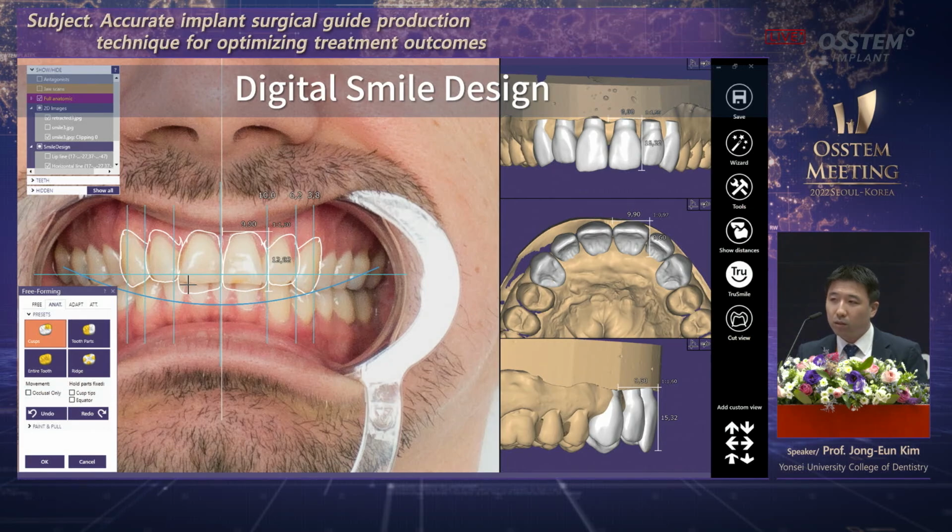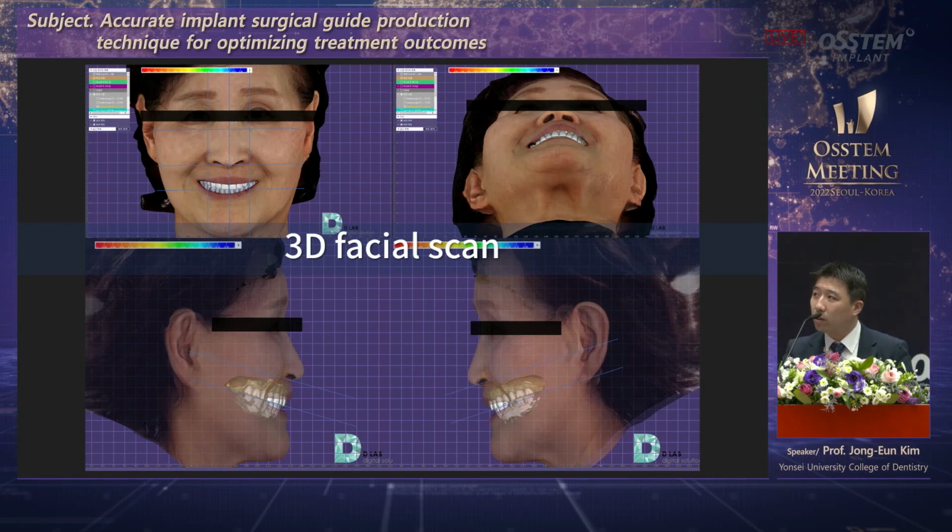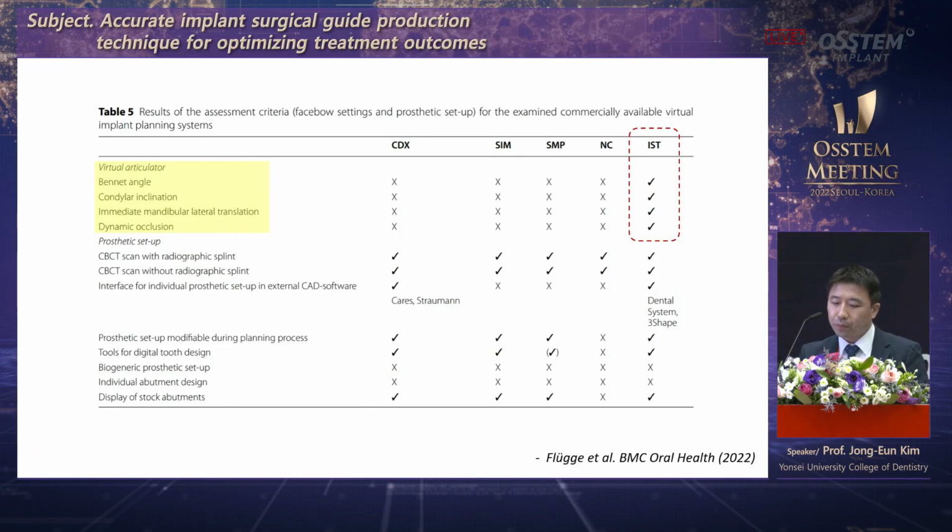You need to get patient images to do digital smile design and align teeth on the anterior area for the same purpose. Facial scan data can be used as well. You not only look at the frontal image, but the lateral image as well, and profile images as well to look at the teeth. If there are a lot of teeth, you also evaluate the occlusal plane using the landmarks of the patient's face and get good results.